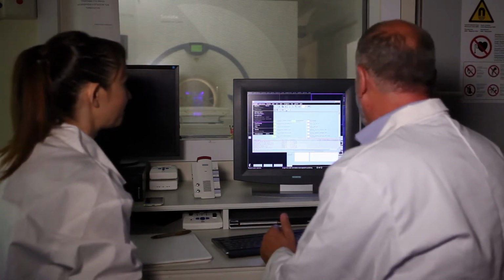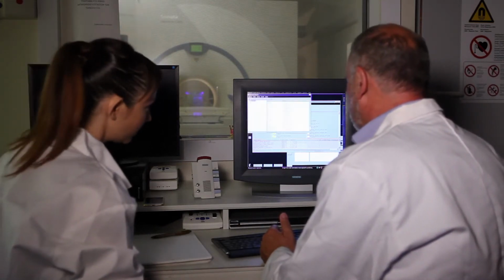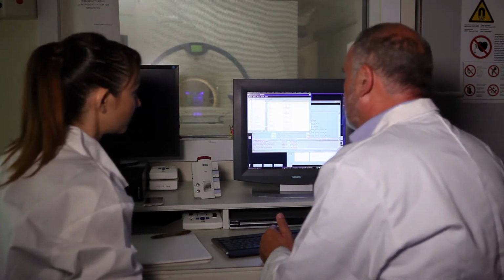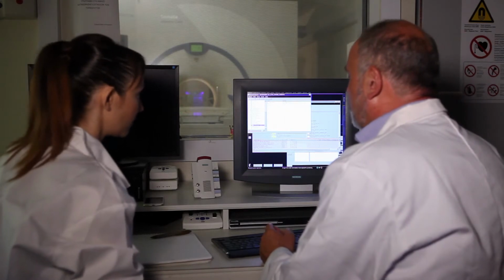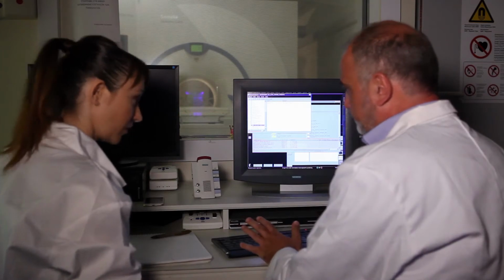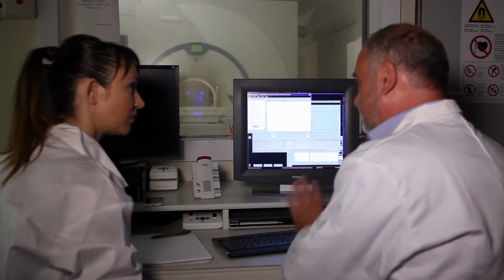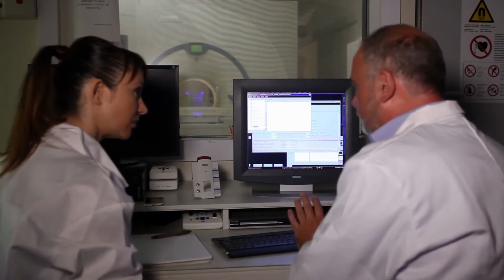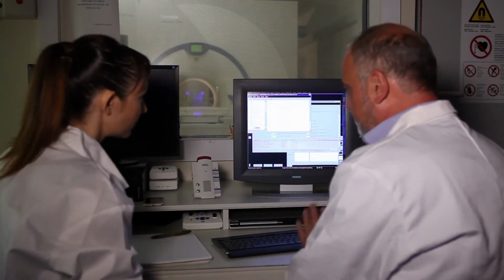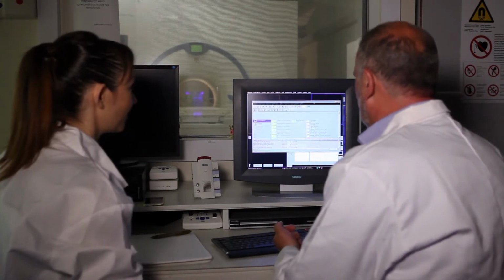We have already arranged the protocol. The protocol is here. You can use it and you can see it's already there. It is called MRI QA, ACR Vision Sonata, which is the machine. We have 2 modes, the standard and the advanced protocols for QA. We're going to use the standard QA. All the sequences are there. We're going to use the head coil. We have a different protocol for each coil. For the head coil, we have already assigned the sequences one by one. So everything is settled. We're going to go and discuss what's going to happen at the end.